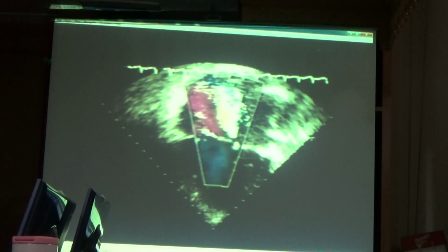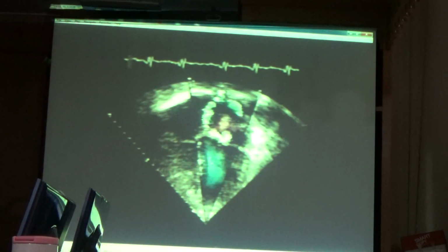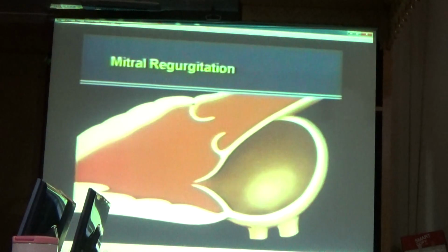The distribution of velocities in the left atrium are notoriously qualitative, and you can have gross under or overestimate of the magnitude of severity, and this is highlighted by another patient, same projection, apex down, four-chamber view, but an eccentric jet of regurgitation. We all know that we can have gross underestimation of severity when the jet laminates against the wall of the cardiac chamber, in this case left atrium. But let's sort of talk our way through this.